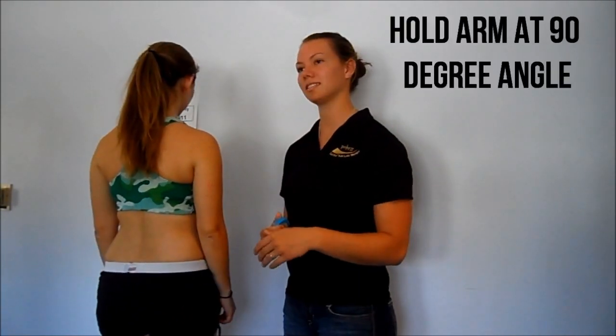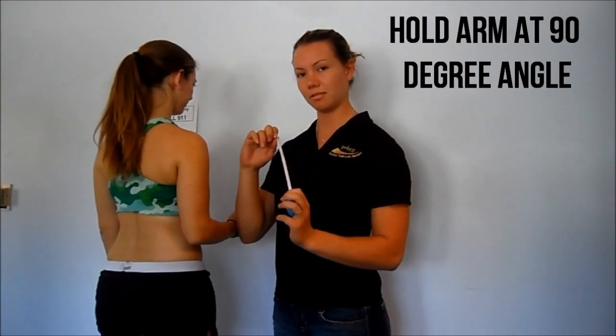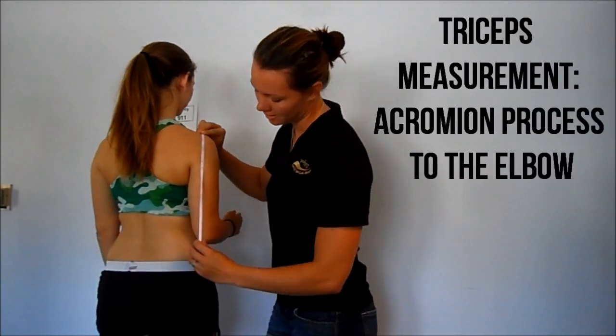First we'll be showing you the three sites for women. The first site is the tricep, so Katie could please turn around. Ask the client to hold their arm at a 90 degree angle and then measure in centimeters from the acromion process down to the elbow.